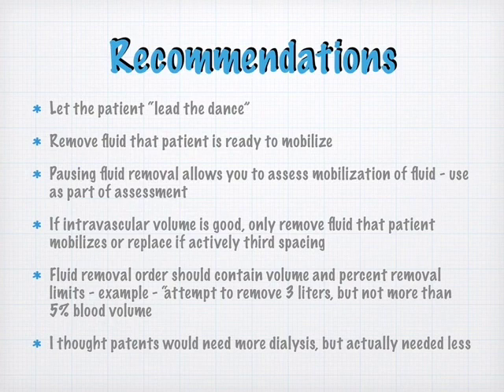So it was a pretty neat thing to be able to stop fluid removal for somewhere between 5 to 15 minutes and see if they are recruiting fluid and how fast they were doing it, because I could kind of get a pulse of what they were ready for. So the next recommendation: if intravascular volume is good, only take what the patient wants to give you. Don't try to decrease their intravascular volume. Don't try to increase their intravascular volume. Just take what they want to give you.